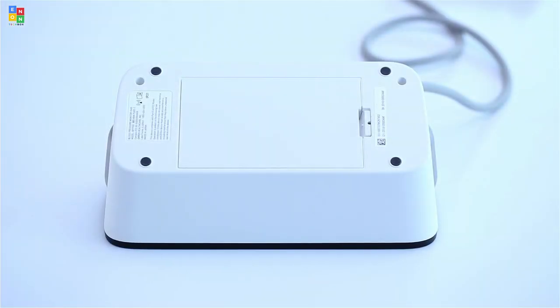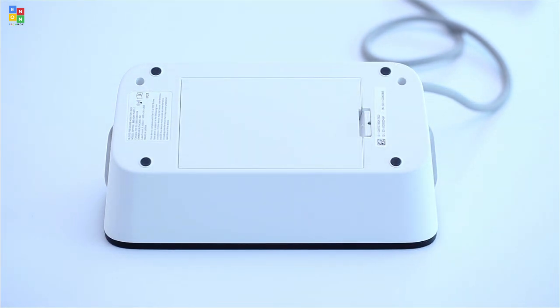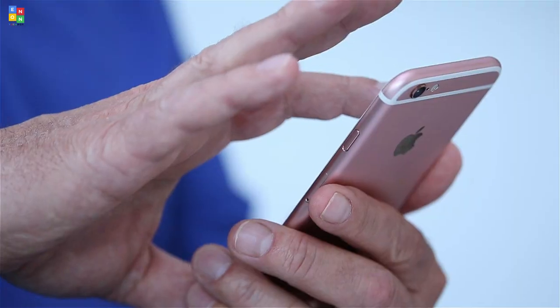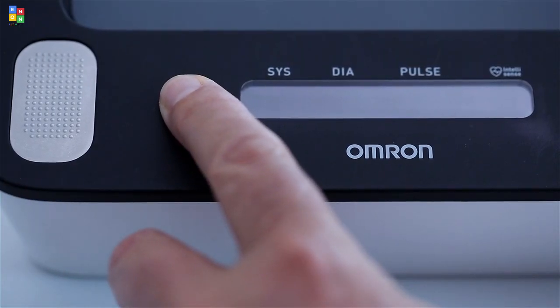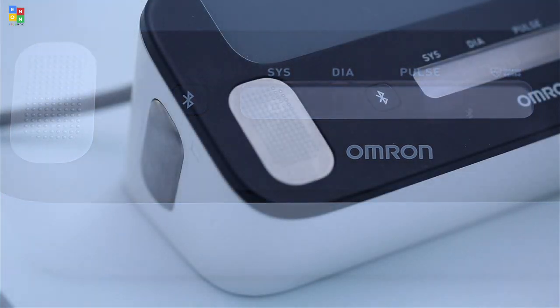Step 1. Turn the device upside down and remove the battery cover. Insert 4 AA batteries as indicated in the battery compartment and replace the cover. Plug the arm cuff into the monitor. Step 2. Download the free Omron Connect US CAN app from the App or Google Play Store. Step 3. Enable Bluetooth on your smartphone and open the app following instructions for pairing.